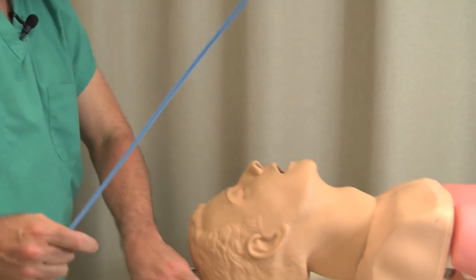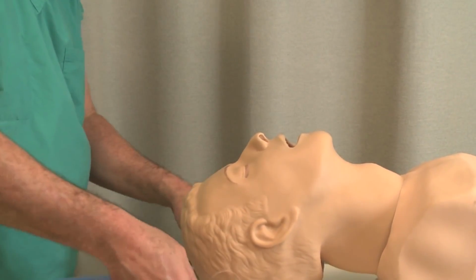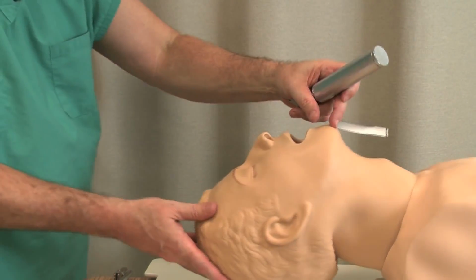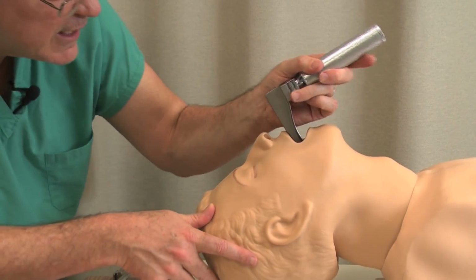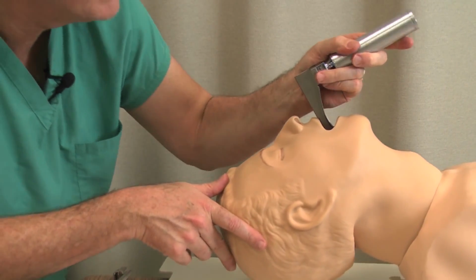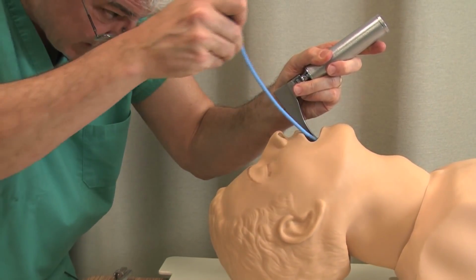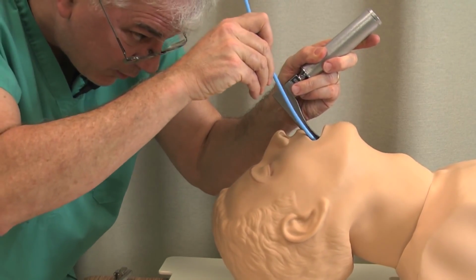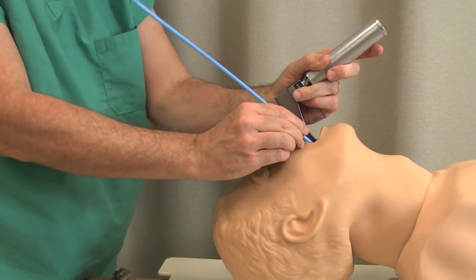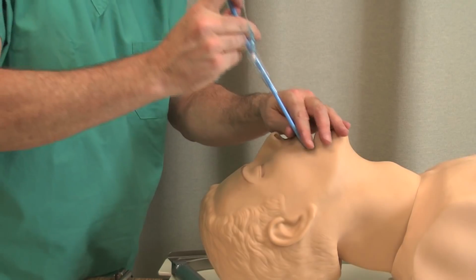I'll show you how that works. Obviously you can't have the stylet in when you're going to have the bougie. So let's see how that works. Good head position, all the rest. I put the laryngoscope in. I just don't quite have the view that I want in spite of the fact that I've done all the right things. So then I take my bougie, slide that in, put that through the cords, and then once this is through the cords, I can slide the endotracheal tube down it.